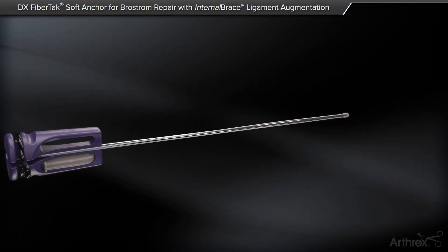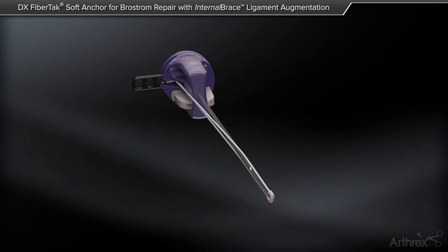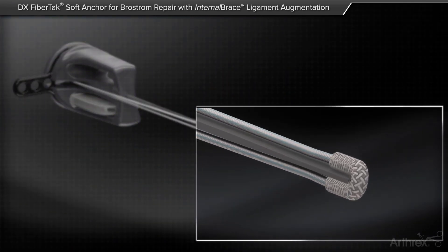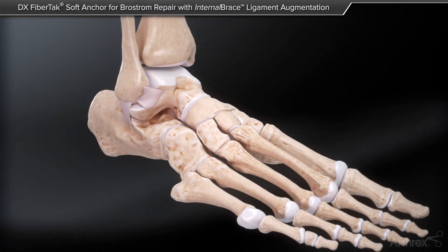The Arthrex DX FibreTac is a small soft suture anchor that can be inserted with a 1.35 mm drill hole. The DX FibreTac comes preloaded with a number one fiber wire suture and needles attached, perfect for usage in open procedures.